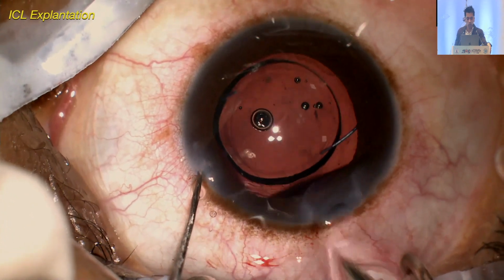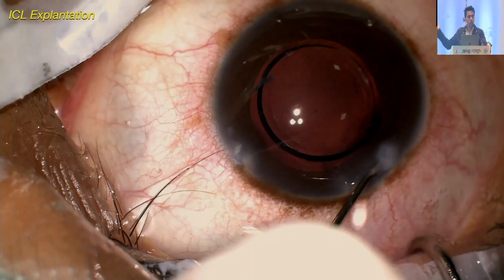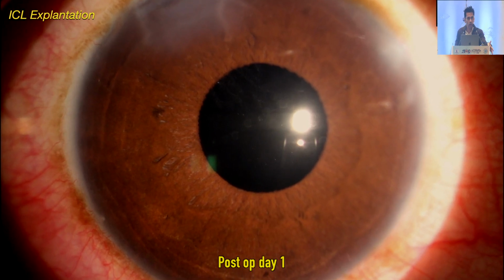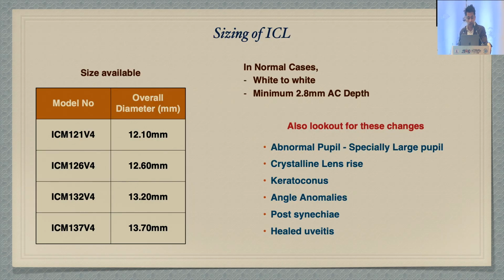I'm just showing you in these cases the cataract procedure as well, because the requirement over here was a cataract procedure for us to remove or explant, and the post-op day looks good. You don't have to really worry too much about that. The effect of the central flow is that you really reduce the risk of angle closure and reduce the risk of cataract formation. Sizing, these are the sizes that STAR sends, and you might want to note this because it's extremely important in sizing.